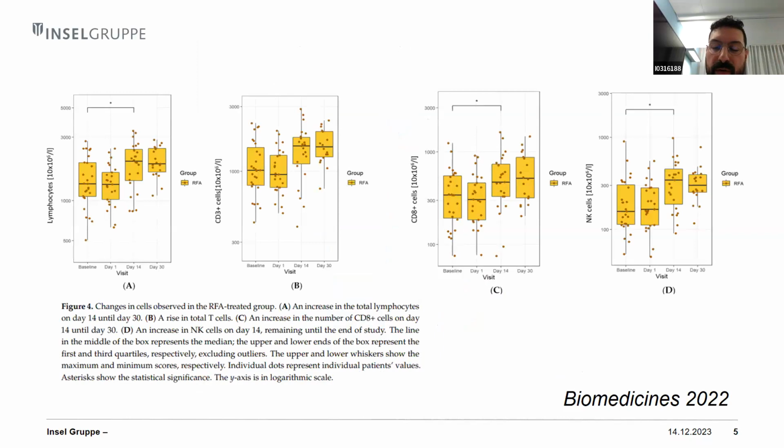Because in addition to direct injury, RFA is postulated to also induce an immune response. In the transitional zone we saw earlier, multiple studies have shown an increase in inflammatory infiltrate, as well as B cells and T cells that are specific to the ablated tissue.